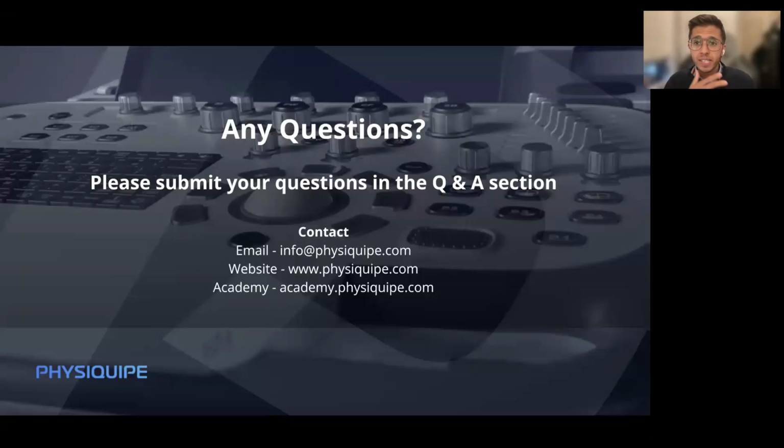On the flip side of things, you can use it as often as you see the patient really. If you're confident and you scan the same place at the same time, it's really helpful to actually look at healing. Particularly muscle healing and tendon changes, which is that last case we went through, can be really helpful. But again, you really need to be experienced and confident in it.